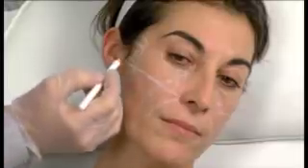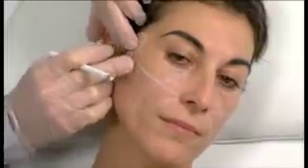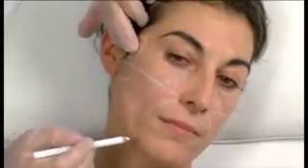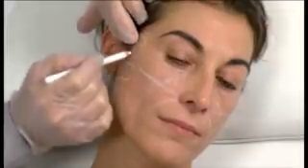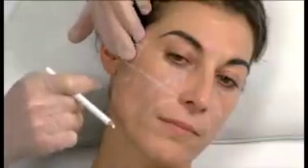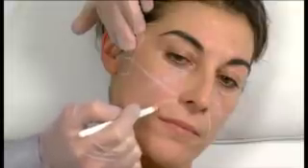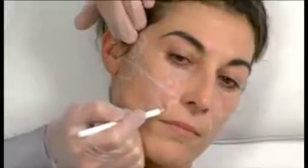So for lifting, we want to come back to the V-shaped face, and we can use our anchor point to actually lift the face. So if I take this anchor point and I pull, I can see that she would benefit the most from actually this direction. So this is my vector. You have to really look at your patient and feel where your direction is. And I feel that she would benefit most if I point my target towards this side. So from here, I want to pull towards here.